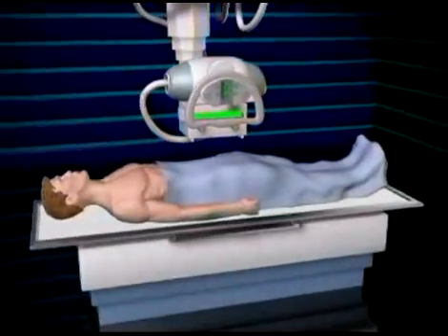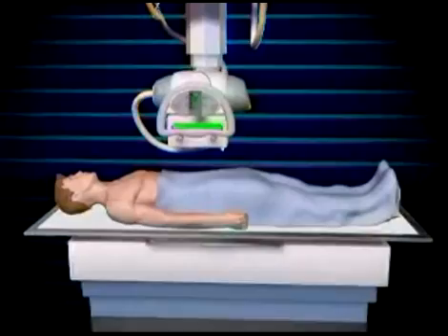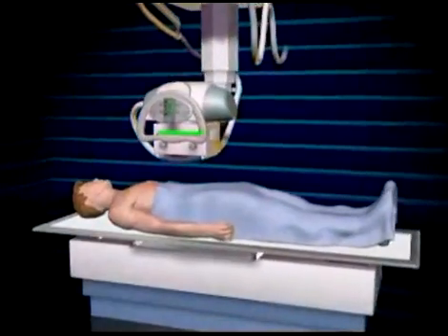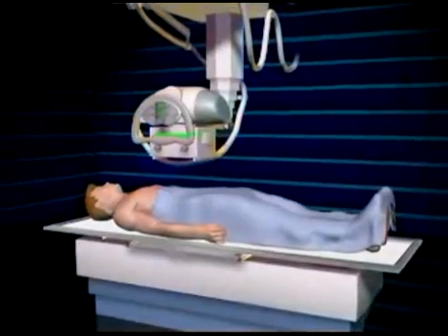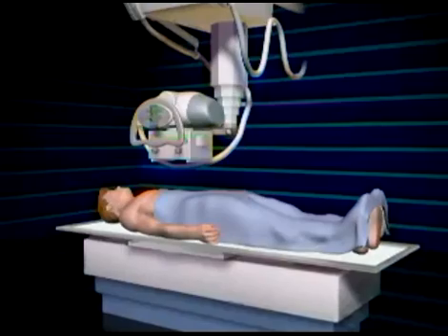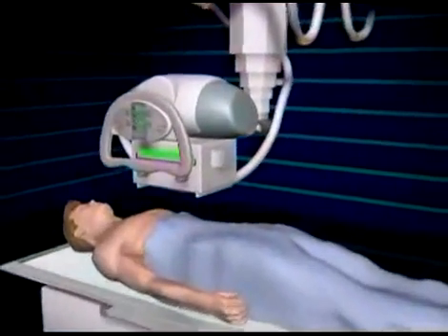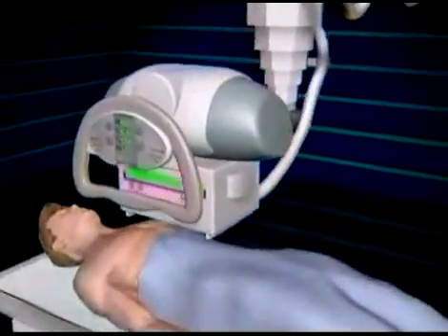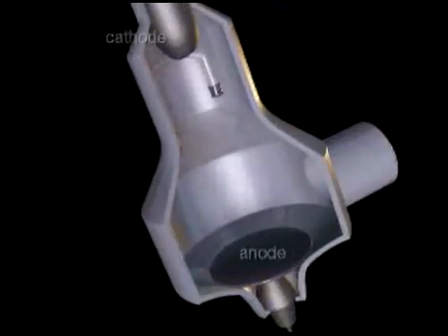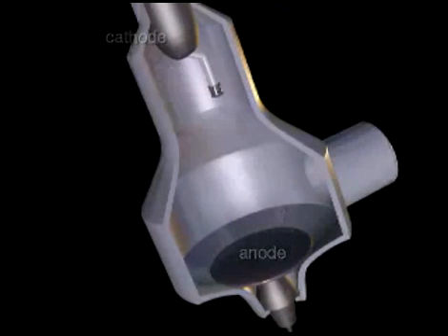X-ray technology utilizes high-energy rays that can pass through certain body tissue and create imagery vital to diagnosis and treatment. The X-ray machine is composed of an X-ray tube that contains a pair of electrodes, or conductors, called a cathode and an anode.